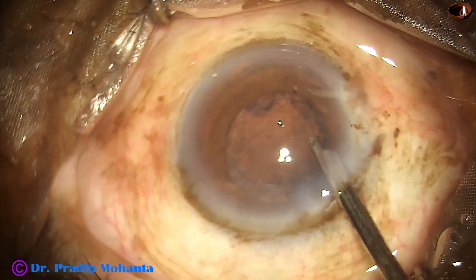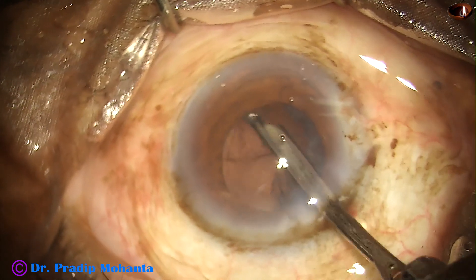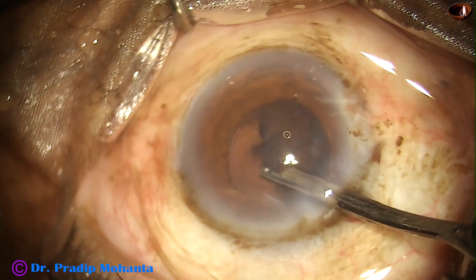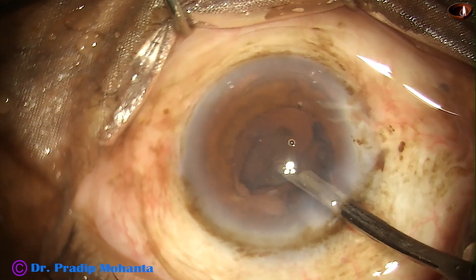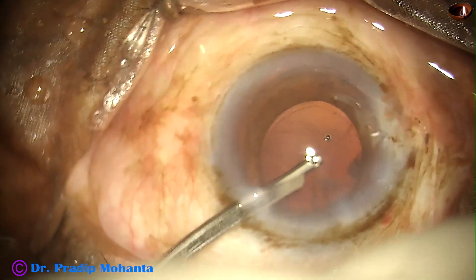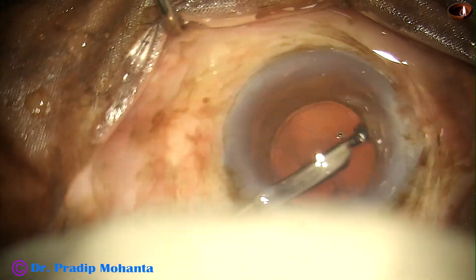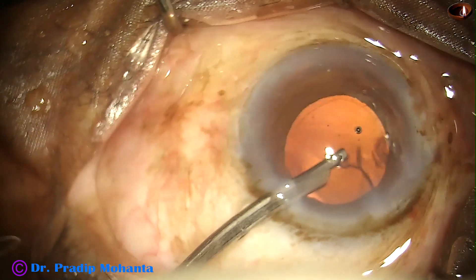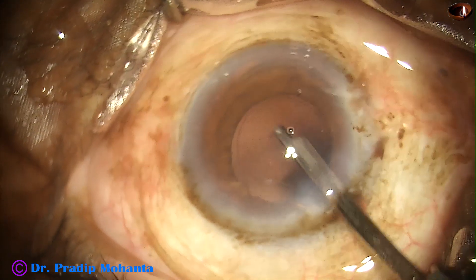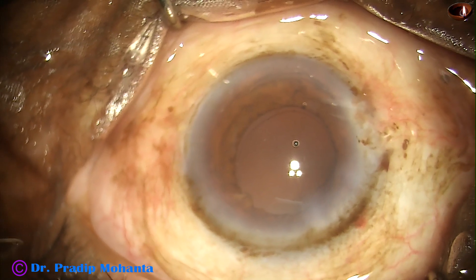In this case I have made only one side port, so either coaxial IA or a 23G Simcoe is used to clean the cortex. And here we can see a beautiful red glow, because of stereo coaxial illumination of the microscope. The microscope is a true glow microscope from Apa-Sami Associates. The cortex is nicely cleaned.